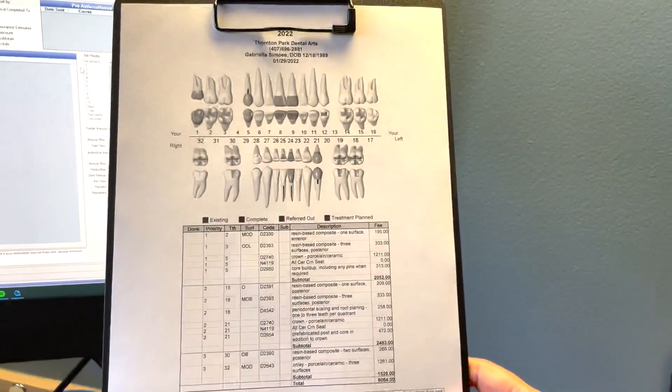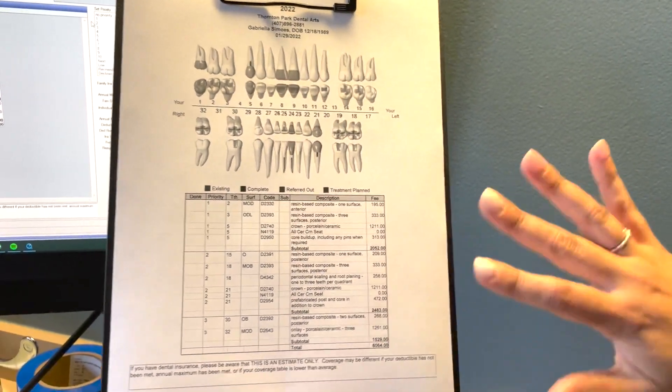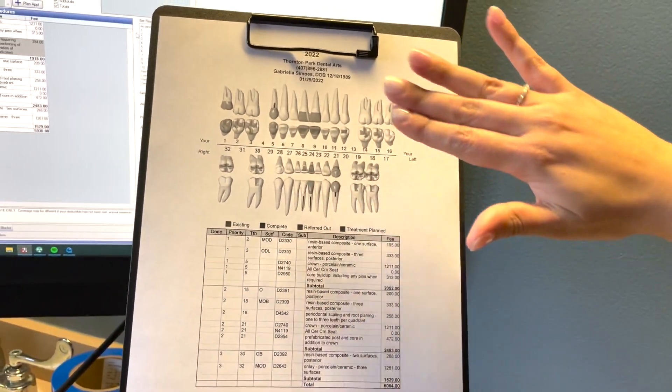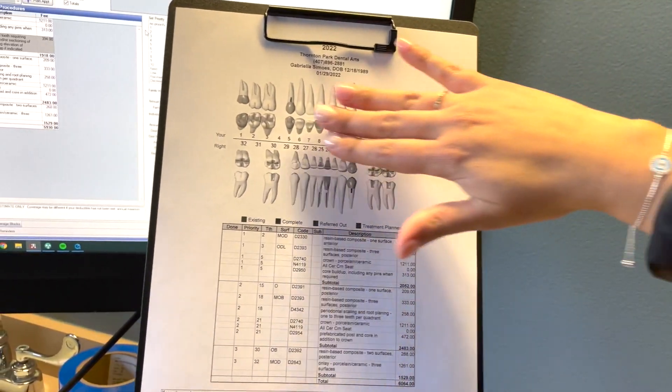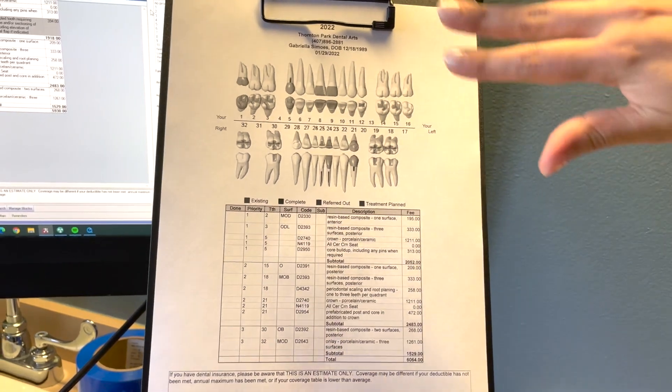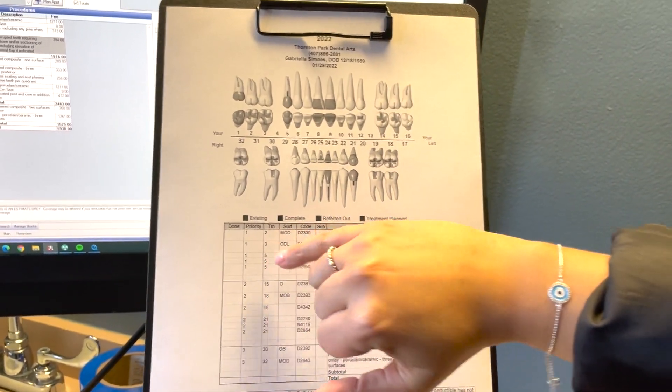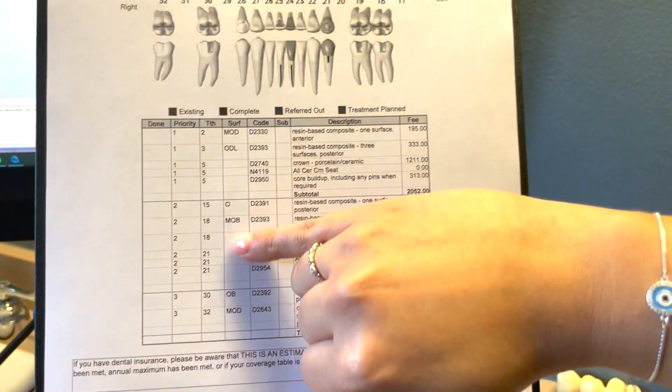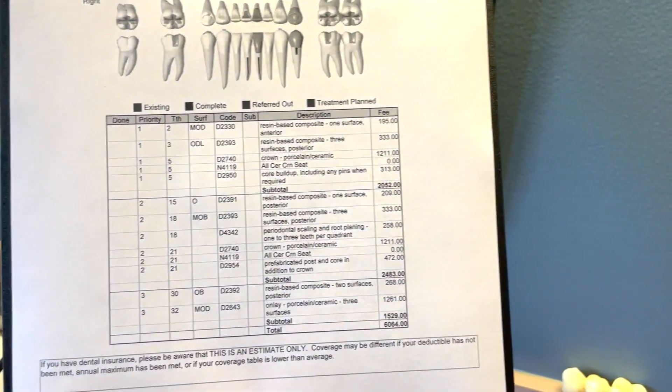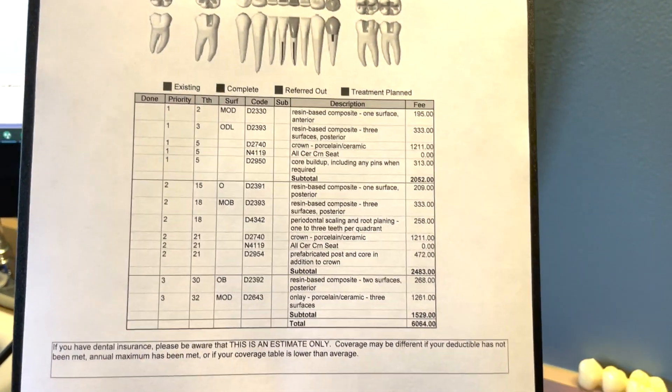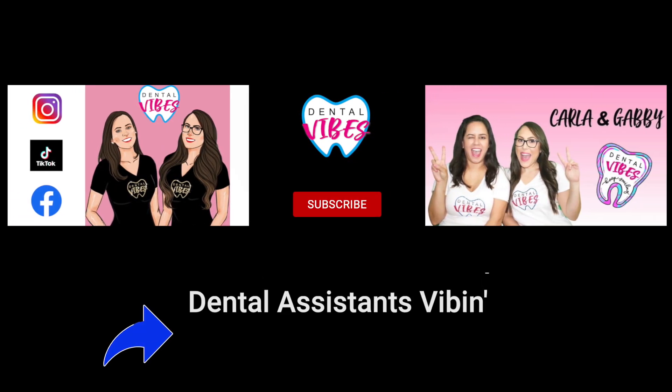And then when you print it out, see how nicely it would look. Now this printed black and white, but if it was color the picture will be able to see what we get to see on the charting. And you see priority, the teeth number, surface, and what the procedure is in the grand total.